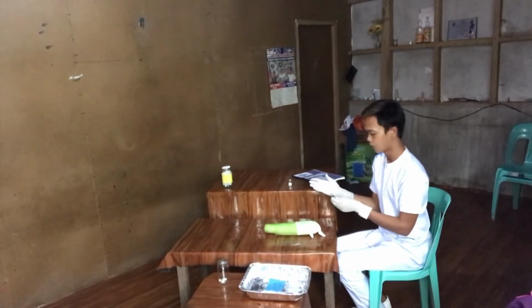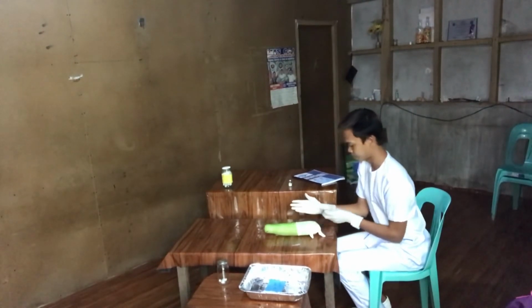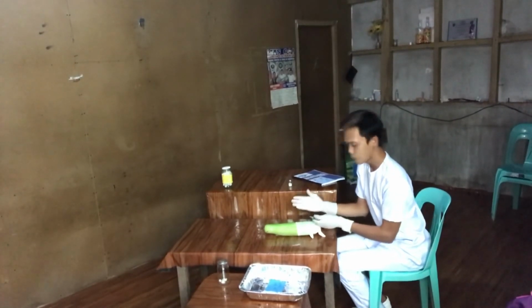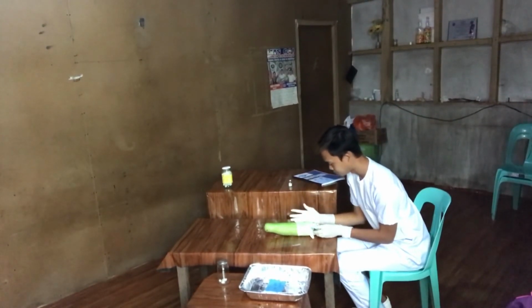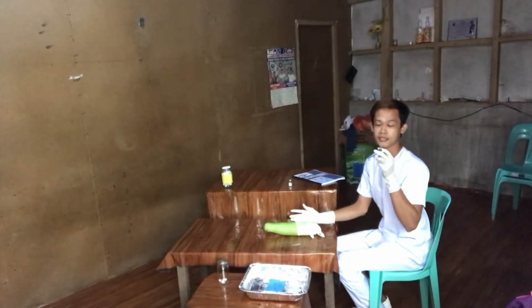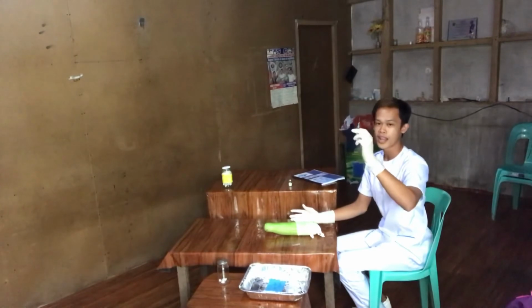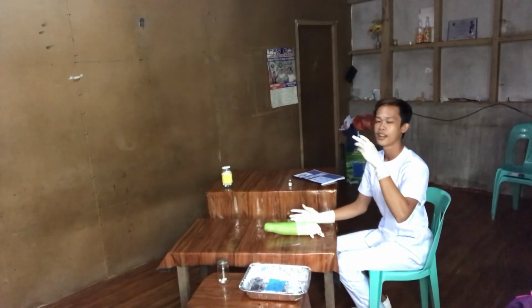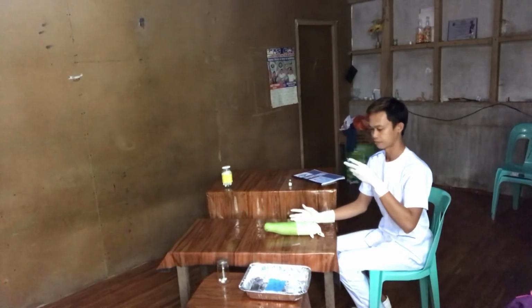We're going to administer the medicine. We're going to place our hands something like this, sideward, to feel for the resistance. Then take our dominant hand with the injection, the needle, and go in like we're throwing a dart, at a 90-degree position.